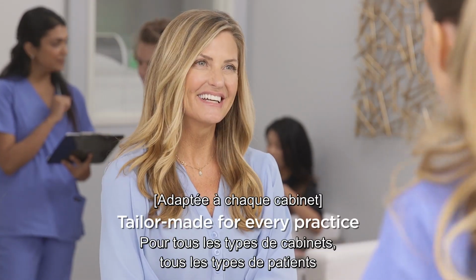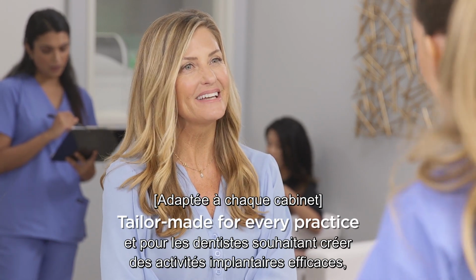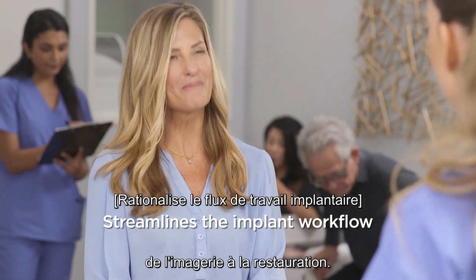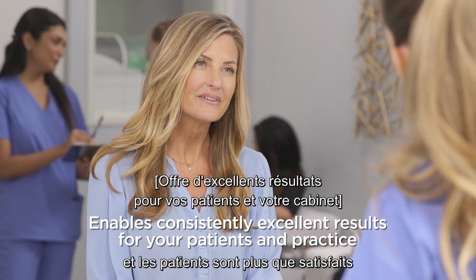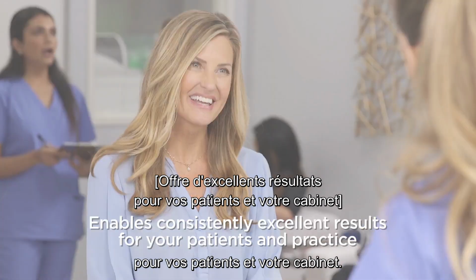For practices of all kinds, patients of all types, and dentists interested in creating efficient implant practices, Azento delivers streamlined and dependable quality from imaging to restoration. Azento enables consistently excellent results and outstanding patient experiences the way you want it, for your patients and your practice.